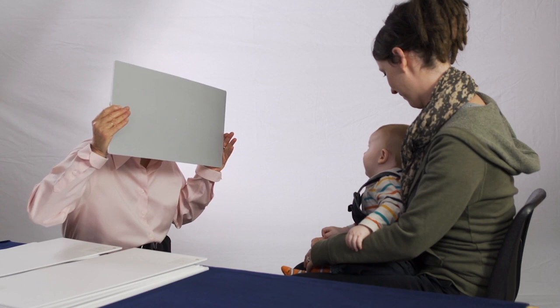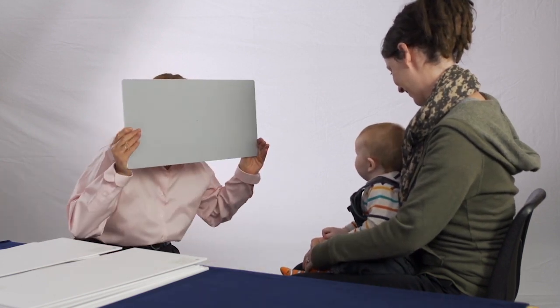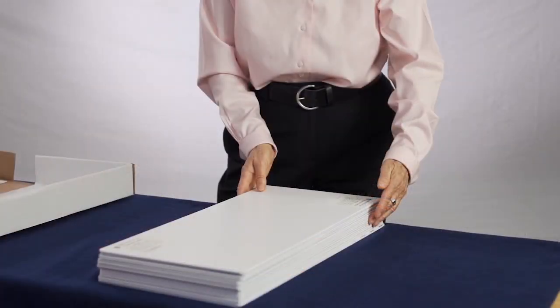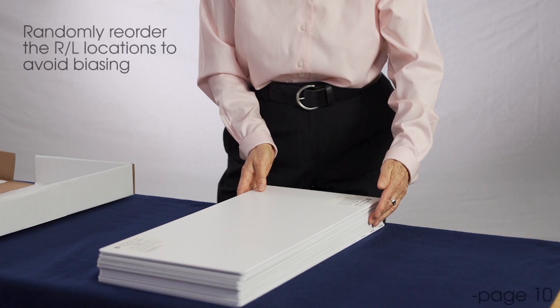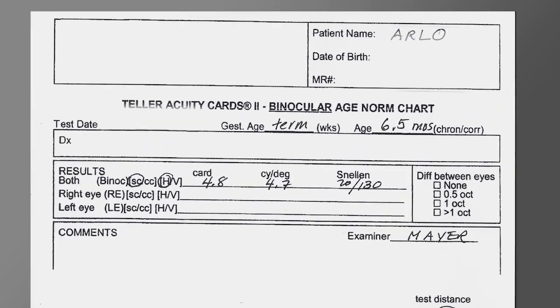Sometimes, retesting results in different decisions on the patient's detection, and the examiner must go back and forth between several cards to determine the patient's acuity. After testing a patient, the cards can be placed in a single stack ready for storage. We recommend randomly reordering the right-left locations of the gratings to avoid biasing the grating locations to one side. As indicated, the finest or smallest grating size that the patient is judged to see by the examiner defines their visual acuity. The recording form shown in the handbook can be used to record information about the patient, such as name, date of birth, test date, and age.